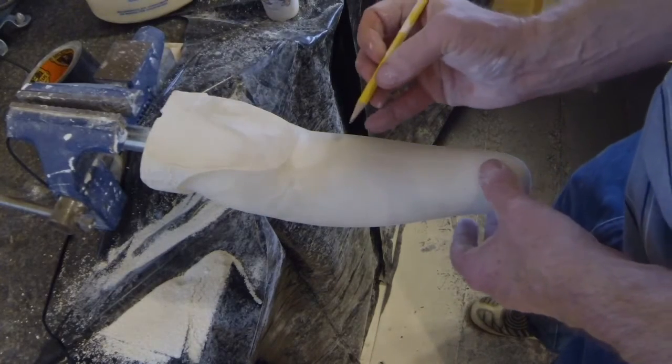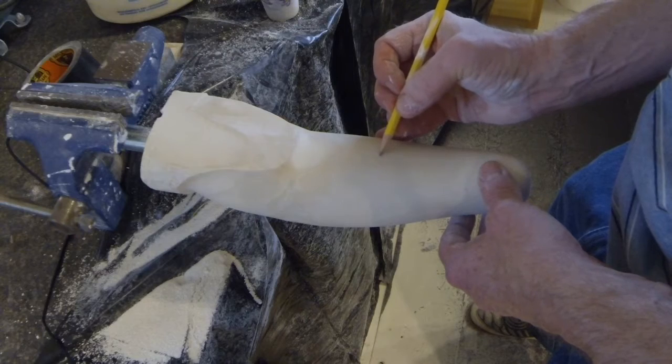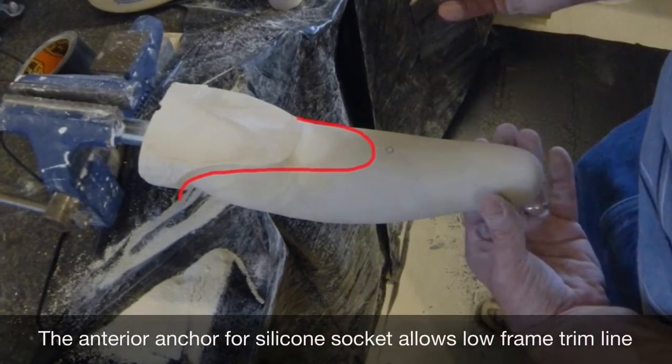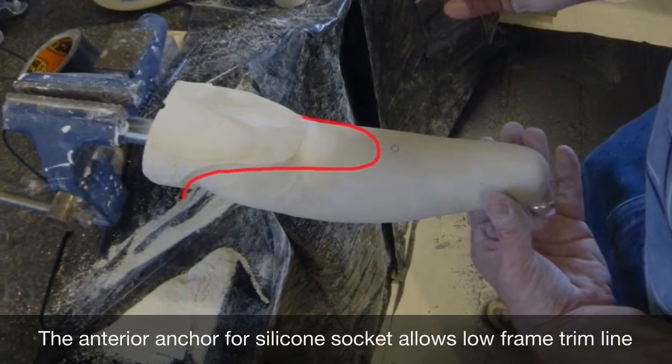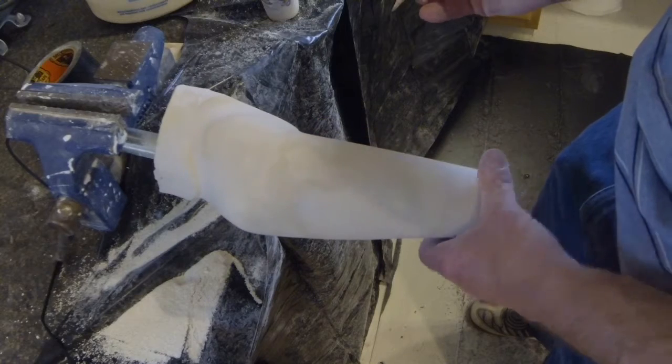For a rolled silicone socket, an anterior mounting anchor is located distal to the anticipated trim line of the rigid frame as shown. One or two mounting anchor locations are marked just distal to the olecranon, being careful to avoid where electrodes may be positioned.